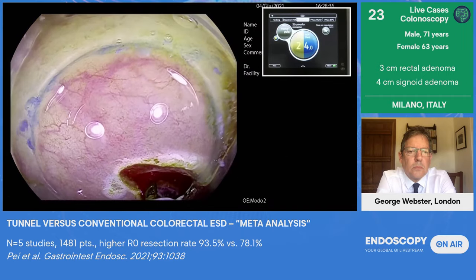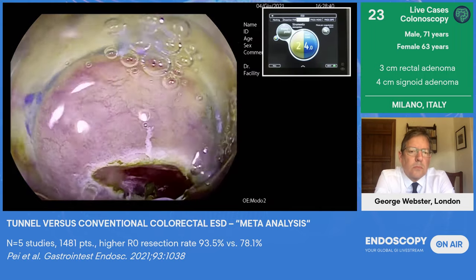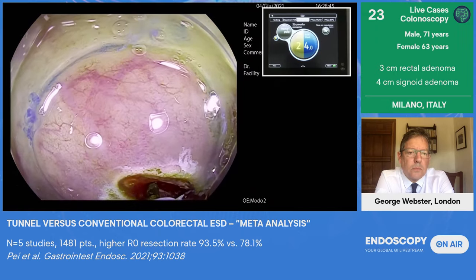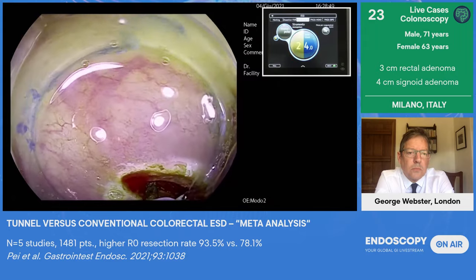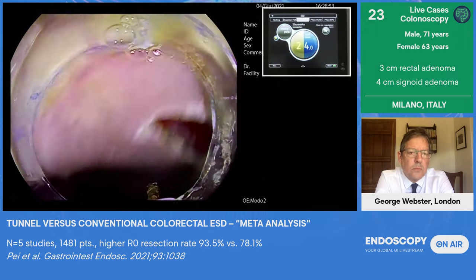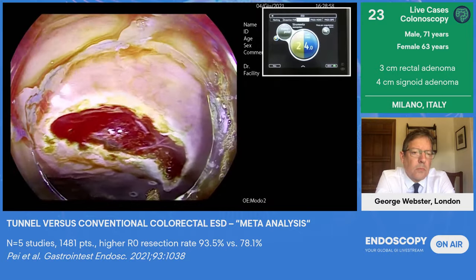Otherwise, I will use a dedicated coagulation grasper. We could use the bipolar forceps, but I don't think it's the case. Let me just try once more. Okay. So let me gel a little bit more. Wait.